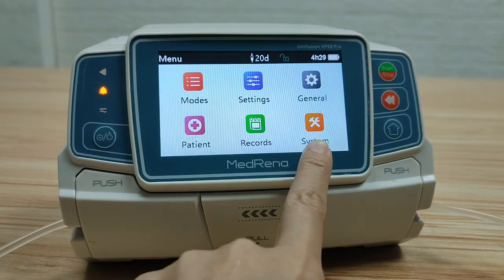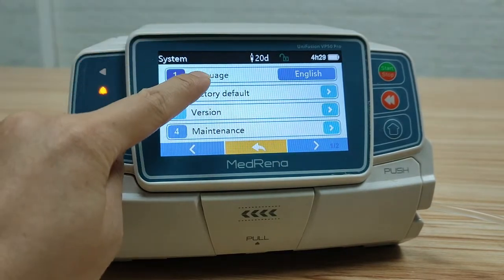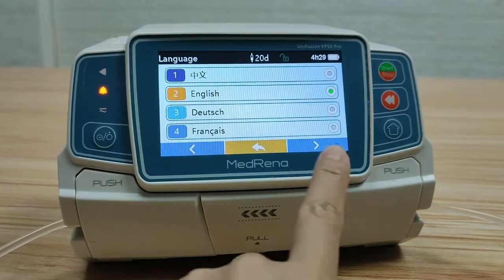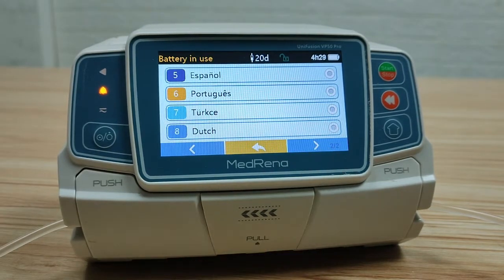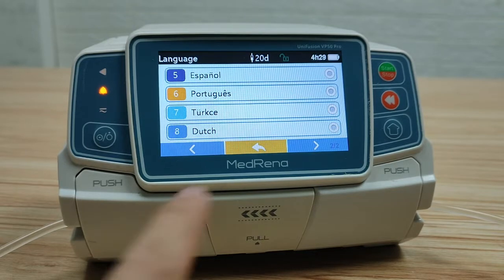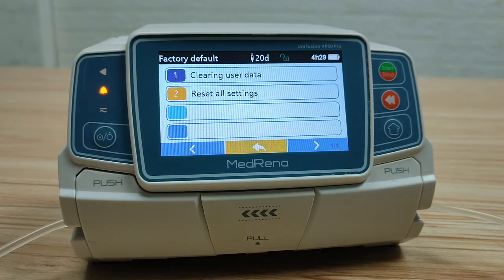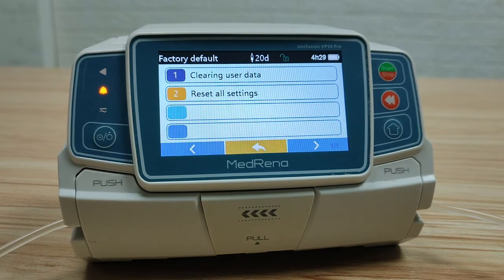The last box is system. First, language — there are eight languages displayed, but more than 12 languages are available overall; please check with us whether your language is available. Factory default: this item is rarely used by end users — please leave it to the service engineer when repair is needed.